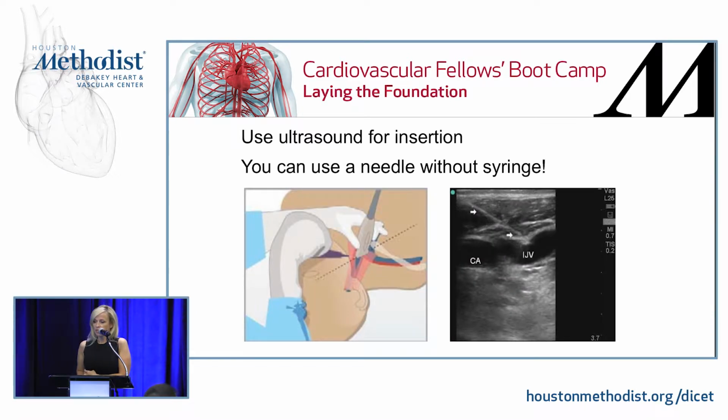Again, 45 degrees, you use your ultrasound for insertion. You can actually use your needle without a syringe because these dialysis patients generally have enough central venous pressure that you don't actually have to aspirate as you're accessing the vein.